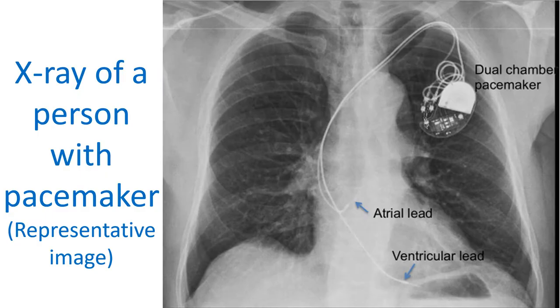Pacemaker is a device used to give regular electrical pulses to the heart when the heart's own pacemaker is not functioning well, or if the signals are not conducted down well to the lower chambers of the heart. Pacemaker is usually implanted under the skin of the chest and connected to the chambers of the heart using lead wires introduced through blood vessels. There is also a leadless pacemaker which can be implanted within the right lower chamber of the heart.